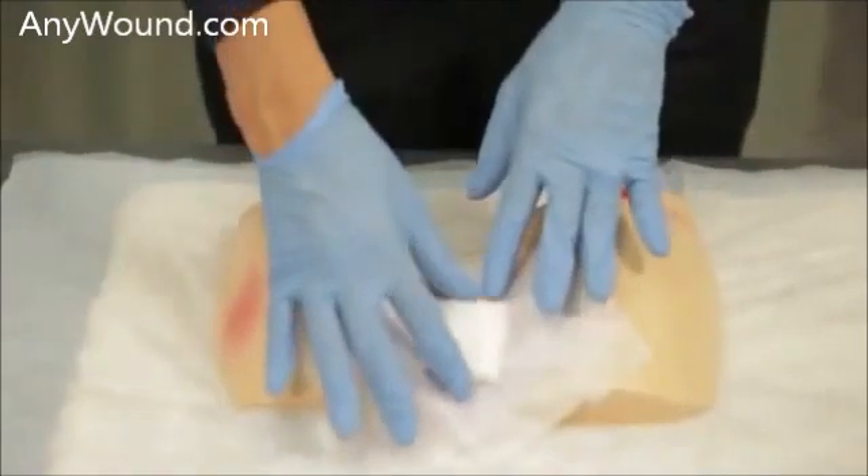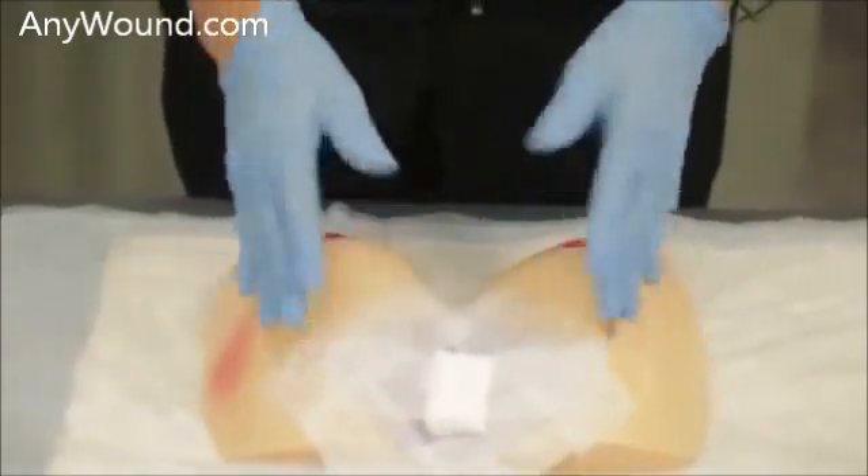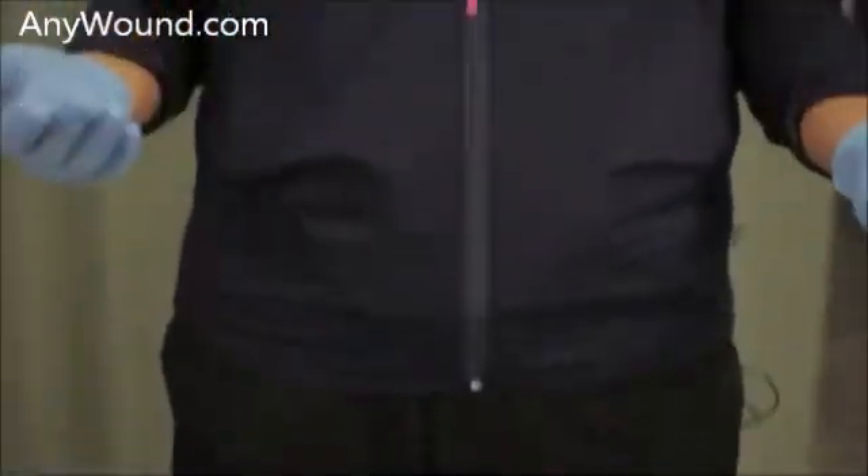This is the placement of the dressing, and that's all it takes. This is just the simple dressing application — it's a three-step process: you clean, you apply the dressing, and you secure the dressing. And that's the full demonstration of Enluxtra.